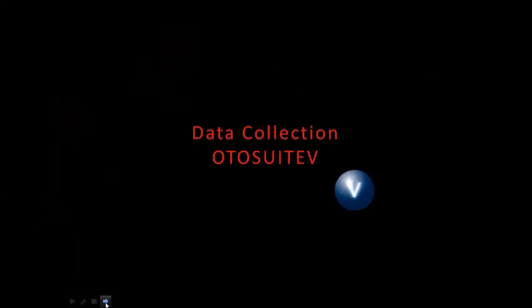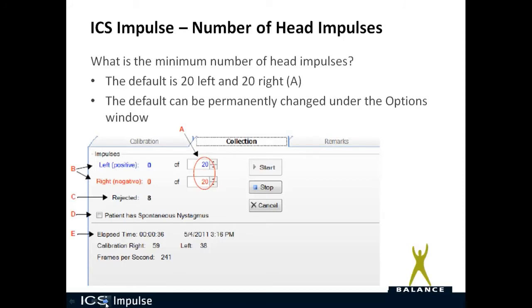Now let's talk about data collection in Otosuite V. You notice that the minimum number of head impulses is 20 to the left and 20 to the right. Obviously, once you get better at doing head impulses, then you can lower that number. But that number was recommended by Halmagyi and Curthoys as a good number to start with when you're first starting out doing head impulses. If you want to lower that number and permanently change it, you can do that under the Options tab.